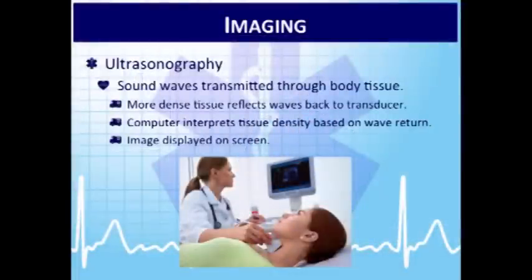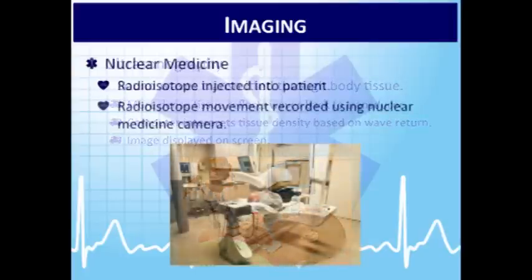All right. Ultrasound, also used a fair amount in healthcare. Most of us are familiar with ultrasound when it's used like on pregnant women to look at the fetus, but ultrasound is used in many, many other ways in the inpatient world. We do FAST exams now, right? You've probably seen in most ERs they're doing FAST exams. It's an ultrasound looking for bleeding that's going on in the belly. All right, so it's looking for fluid and looking through fluid to see what's going on.